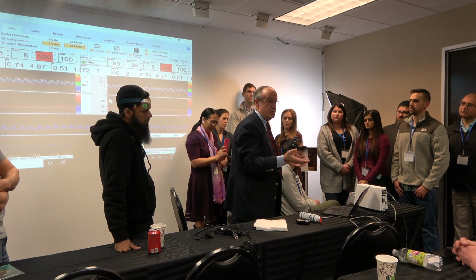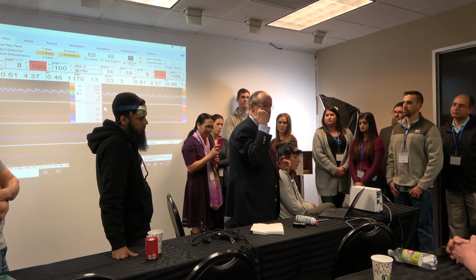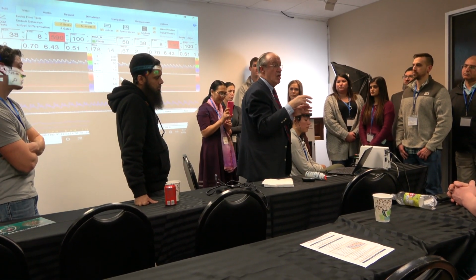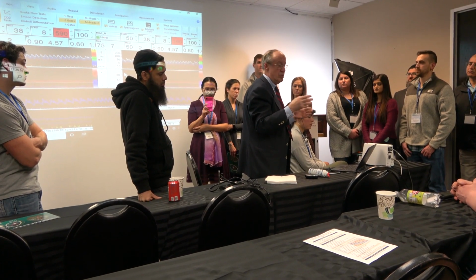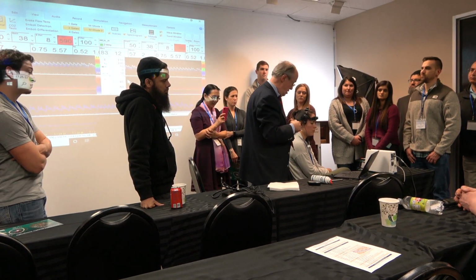But for a fully conscious patient, as Esther now is, we can ask her to push down, and you will see immediately changes in the waveform. So it's very easy to control whether the Valsalva maneuver is done correctly or not. And it could be done in a neurologist's office, cardiologist's office, I mean outpatient clinics.